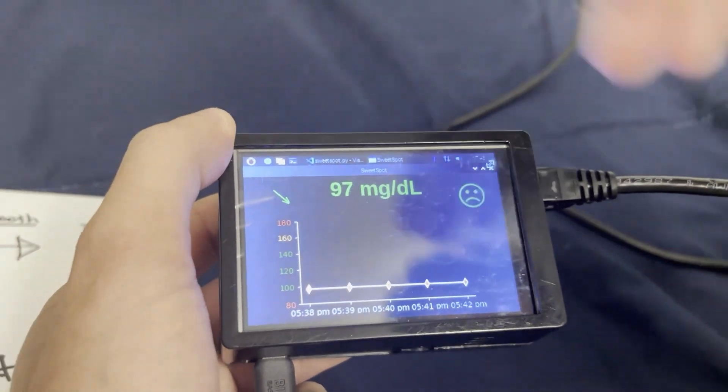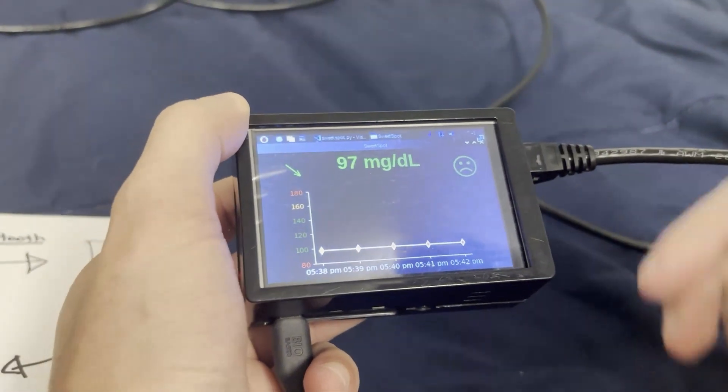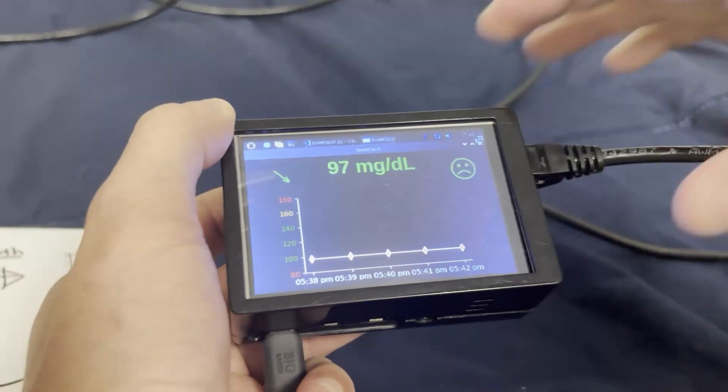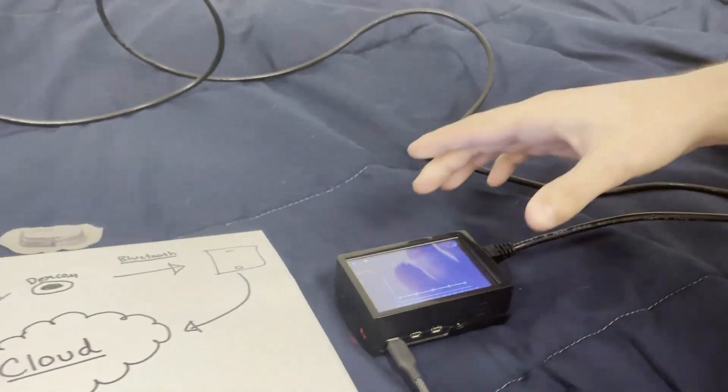There's a trend arrow. I've been trending downward all day, so my blood sugar is 97 and it shows a frowny face because nobody really wants to be 97. We ideally want to be right around 100 to 110.